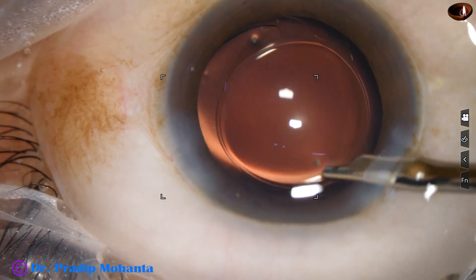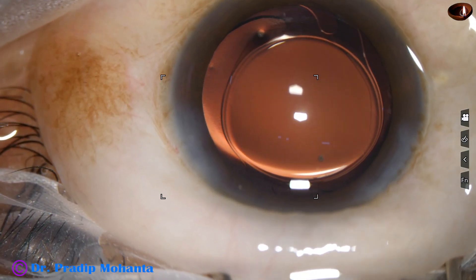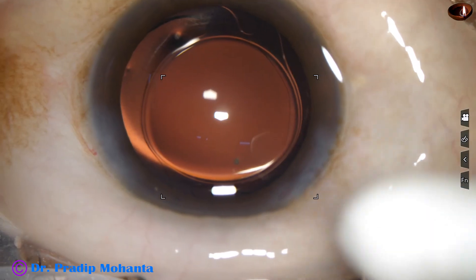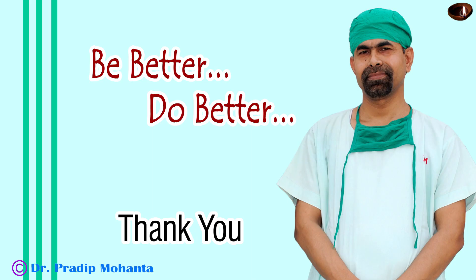If we do this in all cases, the incidence of endophthalmitis will be very, very less. Now the integrity of the wounds is checked and the case is concluded. Thank you very much for your attention. Hope this video will help you in developing your surgical skills. Be inspired to use a pre-chopper — whatever pre-chopper is useful in your hands, please use that. I find this pre-chopper very helpful in soft cataracts, where it is very difficult to hold the nuclear mass with vacuum.